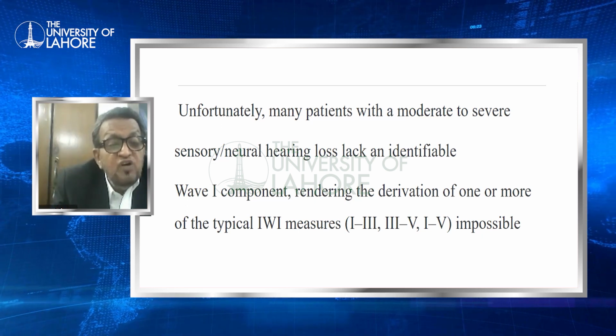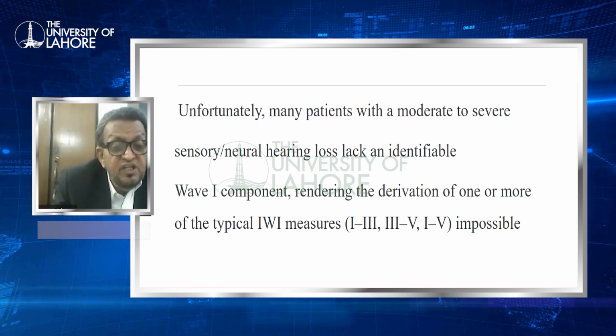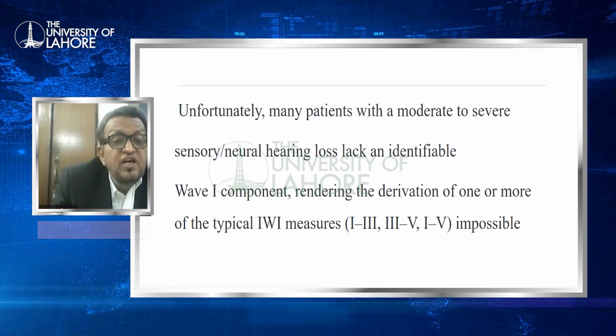So if derivation of one or more of the three interwave intervals, 1 to 3, 3 to 5, 1 to 5, is impossible because wave 1 is not there.